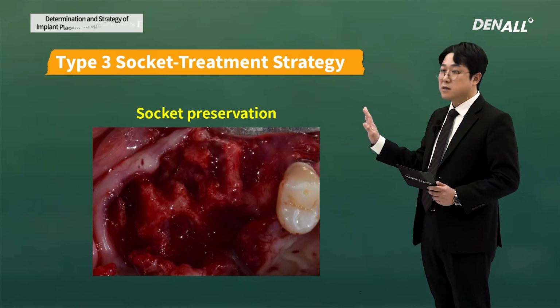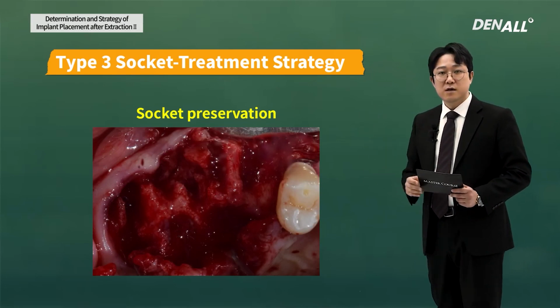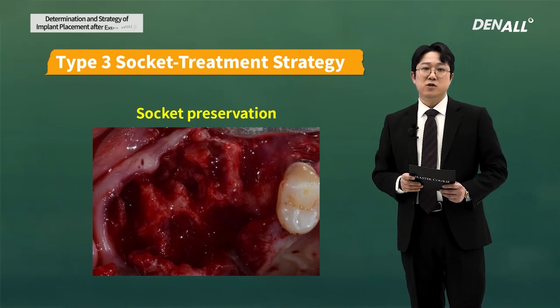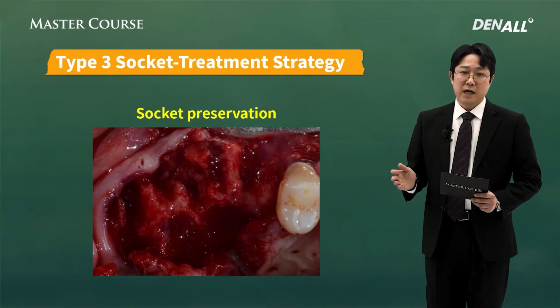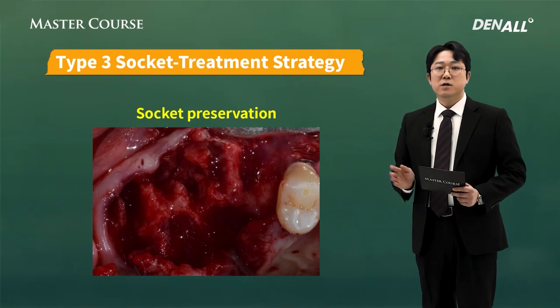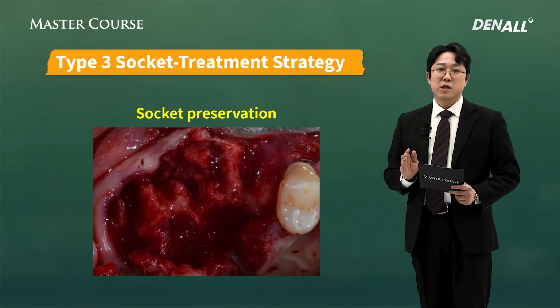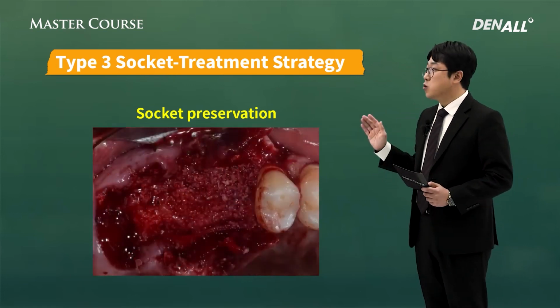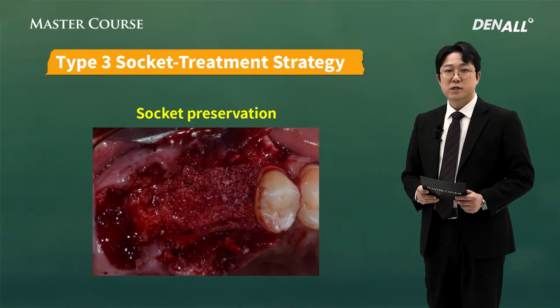As mentioned earlier, mesially and palatally, if you include the epithelialized tissue in the flap, you can use it to replace the soft tissue that is lacking. Dissect it and use it. In this patient, there is septal bone, and you can assume that there will be very nice bone regeneration. Xenograft and resorbable membrane were used, and socket preservation was done.